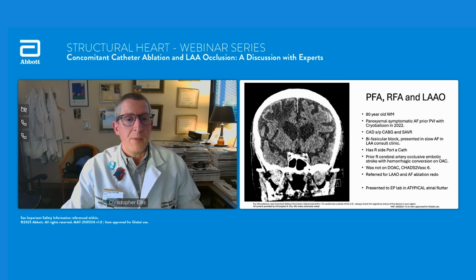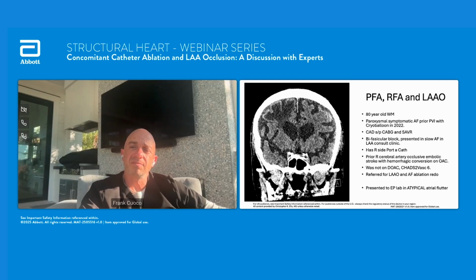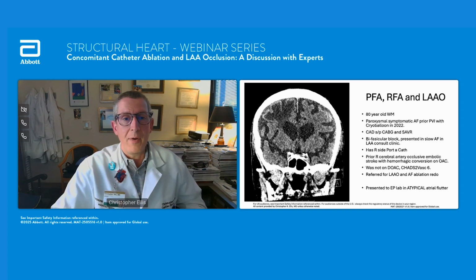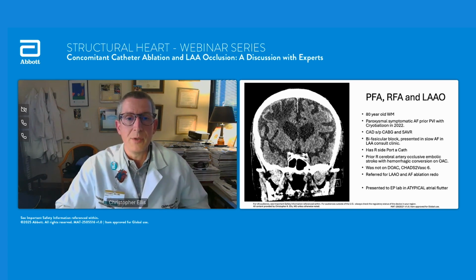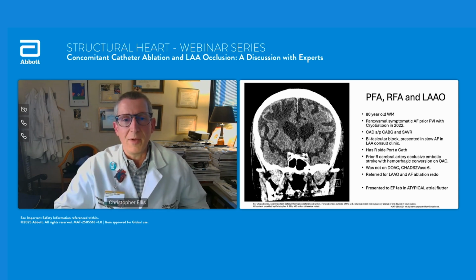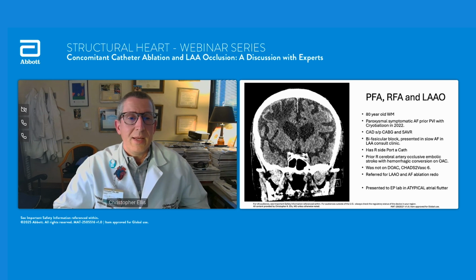So this was a patient I did maybe 9 months ago or so. An 80-year-old man who had been ablated by one of my partners with cryoballoon in 2022. Remote history of bypass and surgical AVR, and as we often see, a total failure of cardiac surgery. The left atrial appendage was not resected or clipped at the time of the open chest procedure, but he came back in to see me in slow flutter with bifascicular block.